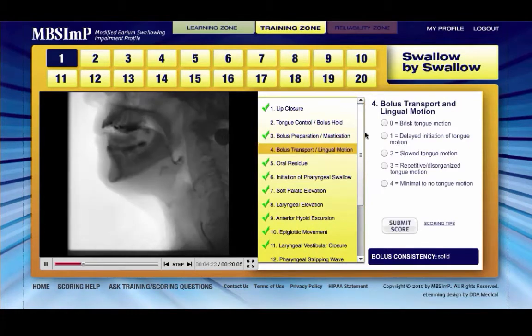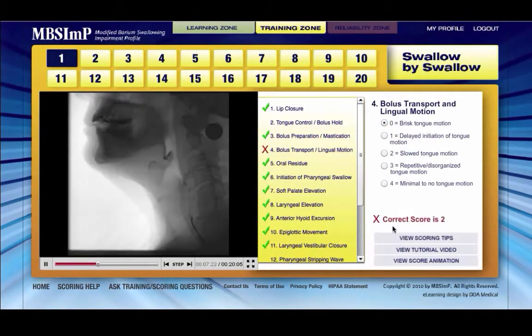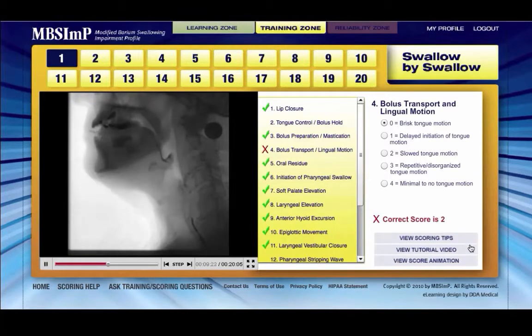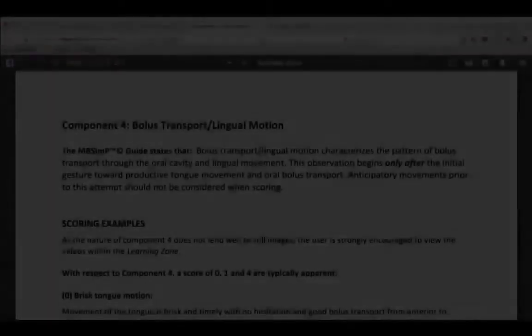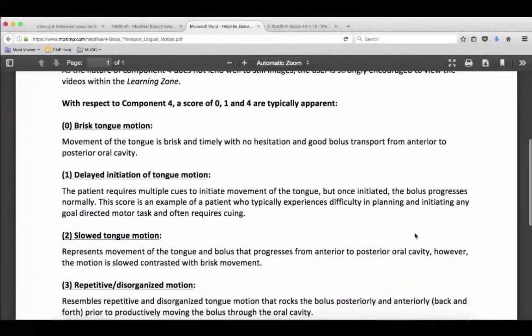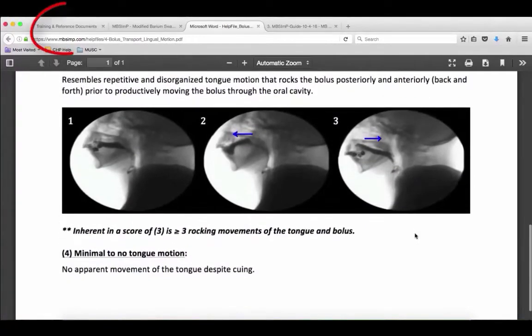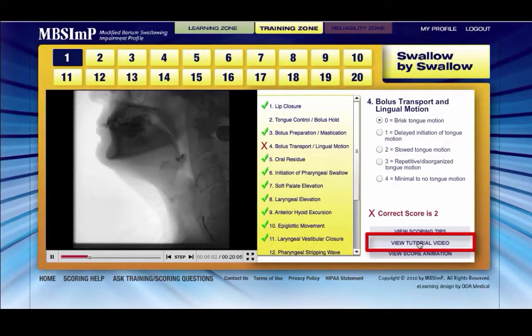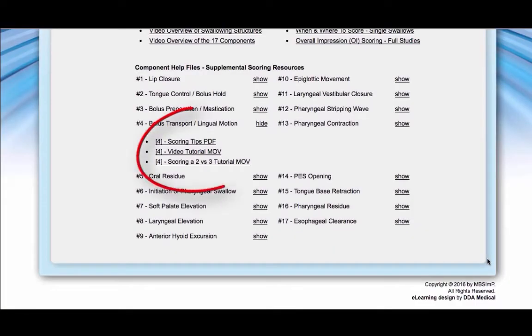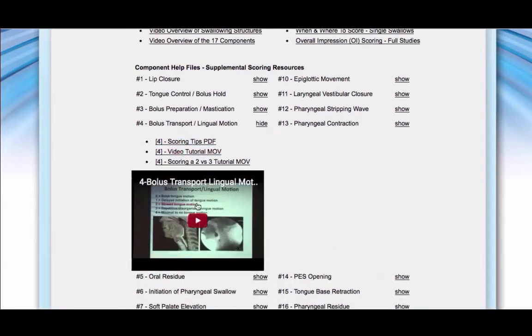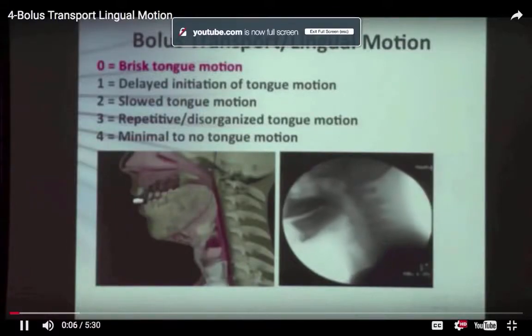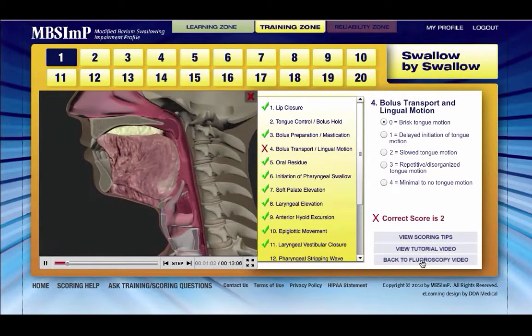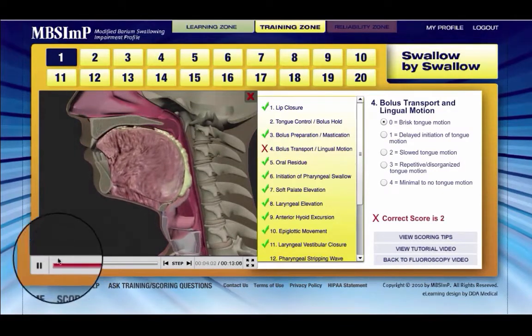Feedback is immediate and states the success of a choice. If correct, move on to the next component. If the score selected was incorrect, the system provides the correct score and the option to view the PDF, MOV, and animation files from the learning zone. The view training tips icon will reveal the PDF help document in a separate tab. To return to the training zone, select the appropriate tab above the web browser. The view tutorial video icon takes you to the scoring help page where all scoring help files can be viewed. Select the MOV file under the appropriate component to review component-specific scoring rules and guided practice examples. Selecting the view score animation icon displays the score-specific component animation from the learning zone in the media player window.